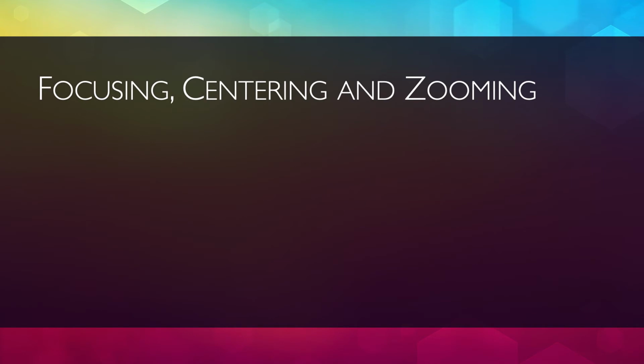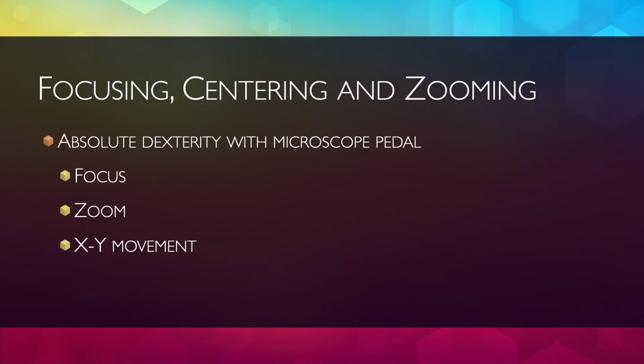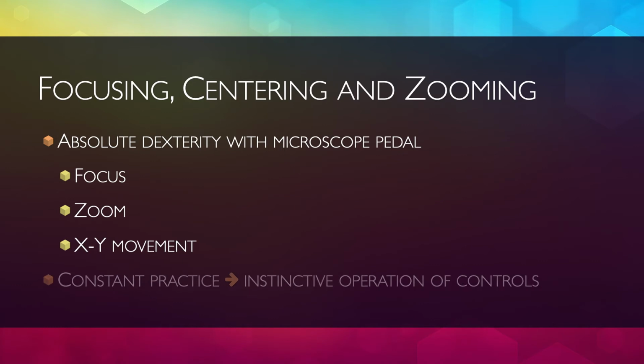In dealing with these 3 requirements, it is necessary that the surgeon achieves absolute dexterity using the microscope control pedal. Constant practice leads to instinctively maintaining things proper, and it becomes second nature.